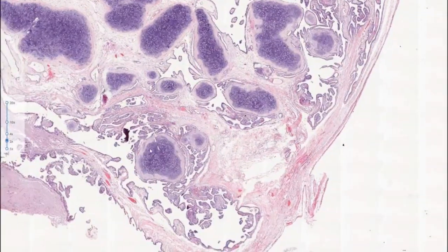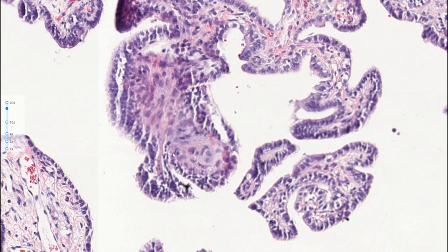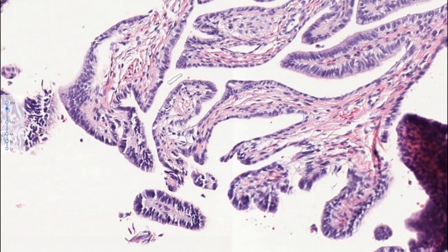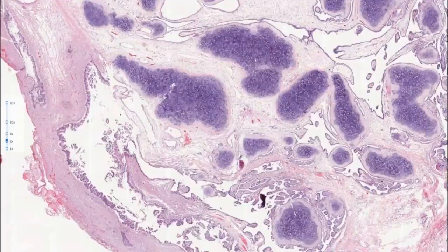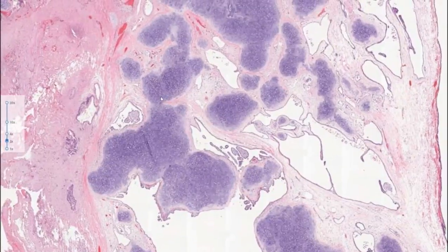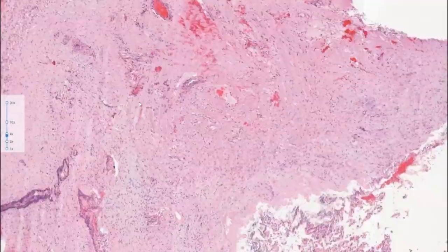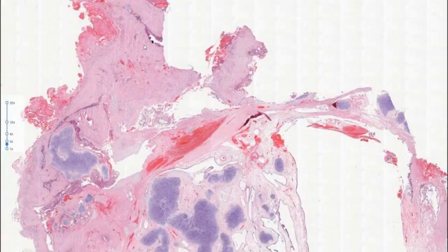And even though this is dominated by the cartilage, you still have histopathology here that is compatible with a choroid plexus neoplasm. Not very proliferative, kind of bland, and a lot of these cartilage islands. This is really a striking presentation. No other epithelial components. You have to start thinking whether this could be a germ cell tumor. We don't see anything else that will support that hypothesis. There's some blood.